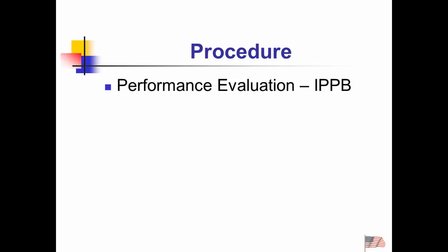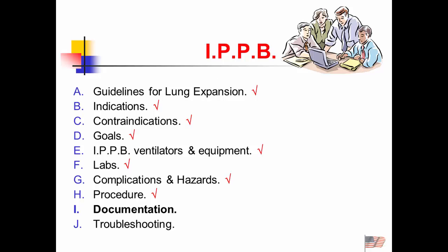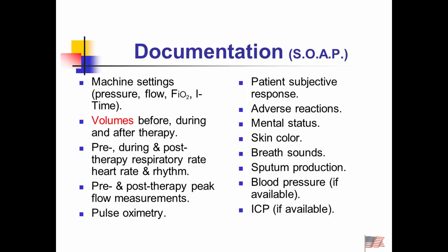Okay, I'll walk through the procedure when we get done, and we'll talk about some documentation, same as you saw with the small volume nebulizer, with the exception now that we're also monitoring the volume, because I want to make sure that the volume expansion component of it is being met. 2 to 3 times the spontaneous tidal volume, vital capacity is above 15 mLs per kilogram.